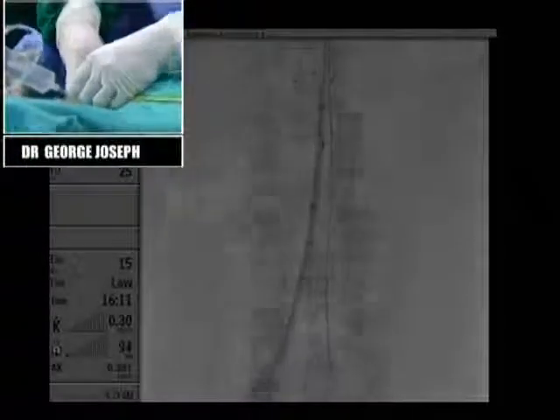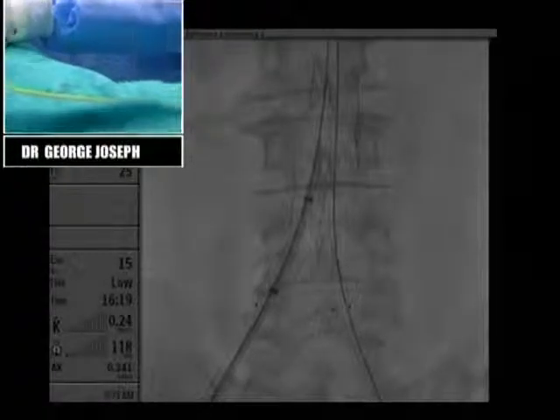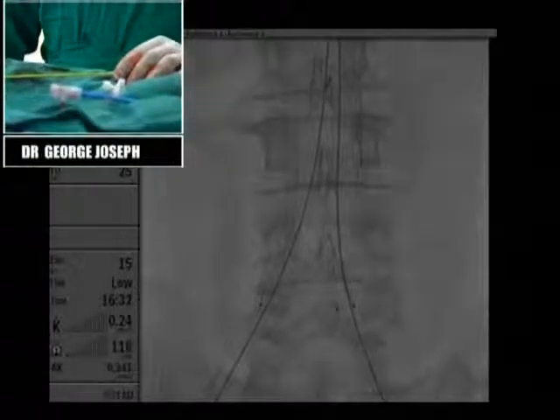Now we'll do the lower end. Lower the pressure. Pull it back. But they recommend to balloon the contact points, especially the contralateral arm. That's a standard company recommendation. Gentle. Okay, now put it on the left. This is a very soft balloon. It is not to expand, it is just to passivate. So we balloon the top end.